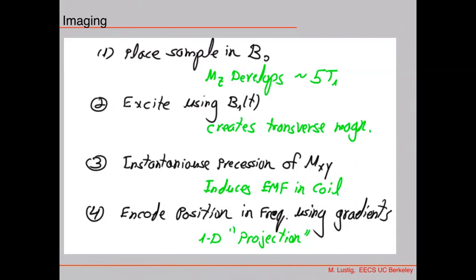In particular, when we do a flow experiment. In a flow experiment, you have a bore, and then you have some reservoir of water, and a pump that flows water into the scanner and then out, and you want to image the flow inside. Well, what happens if the flow goes this way and it doesn't spend enough time inside the magnet? Then the water doesn't magnetize, magnetization is not created, and you get garbage.